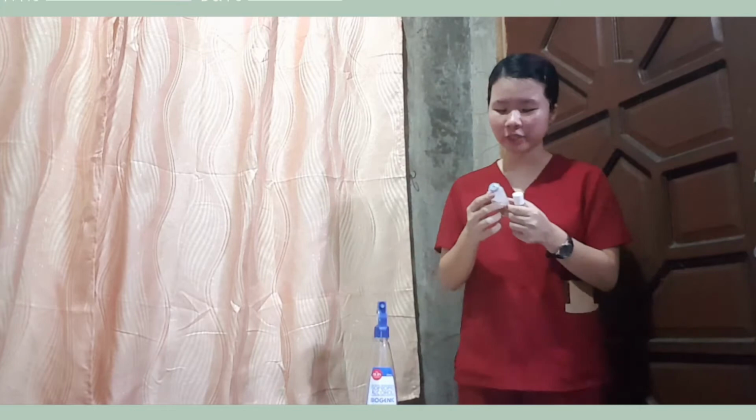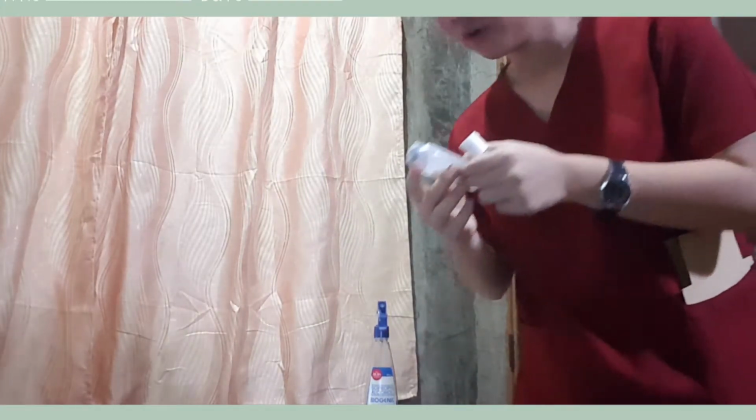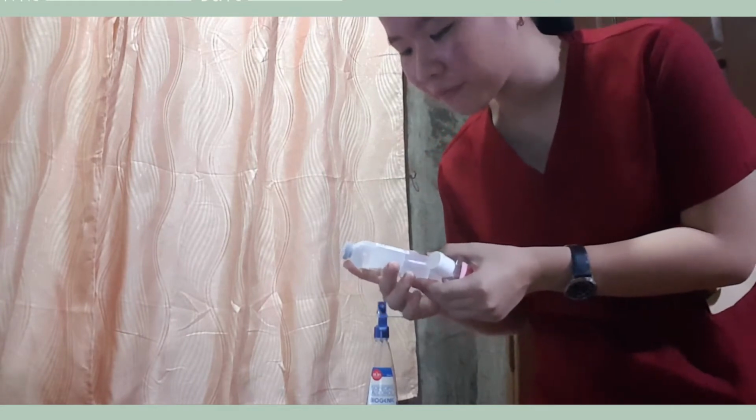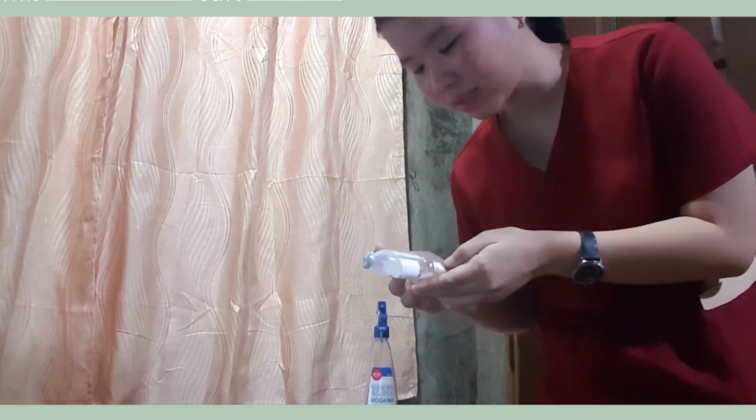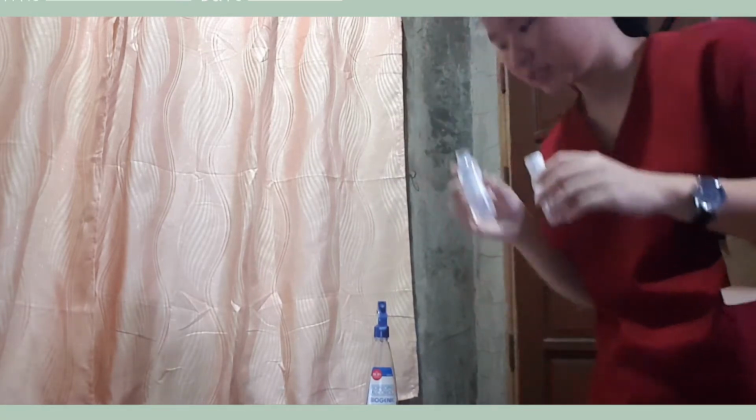It is now confirmed. We are now going to proceed to procedure number 6, which is to check the expiration date, check for the clarity of the regular insulin and the cloudiness of the intermediate insulin. So now we're going to check the expiration date, which is on 14/1/12, and same as the intermediate insulin.